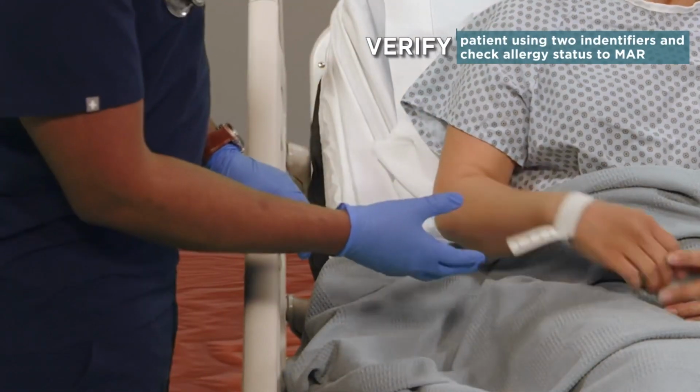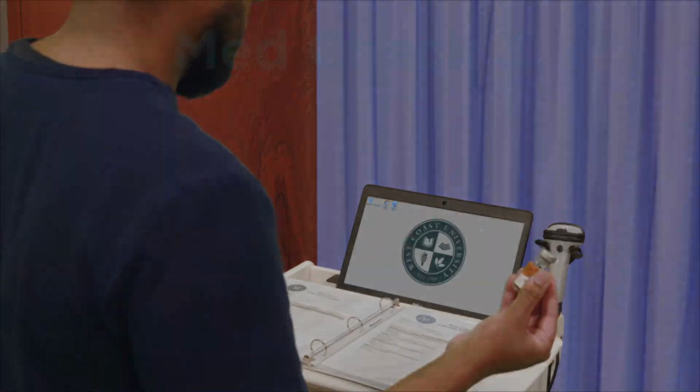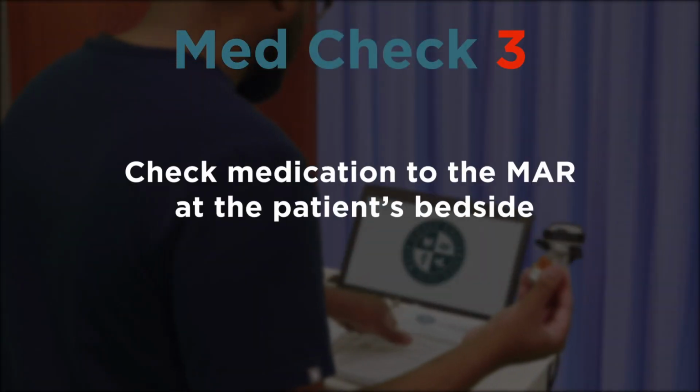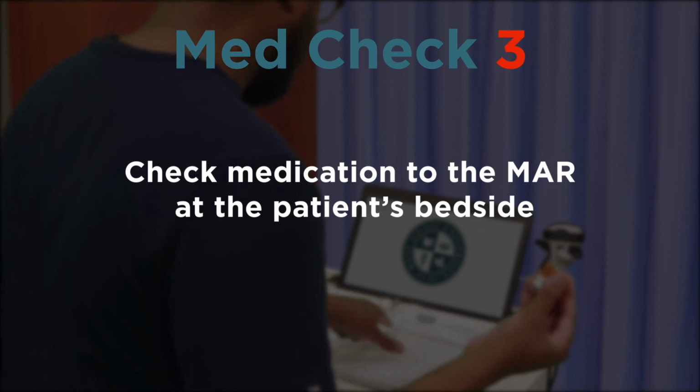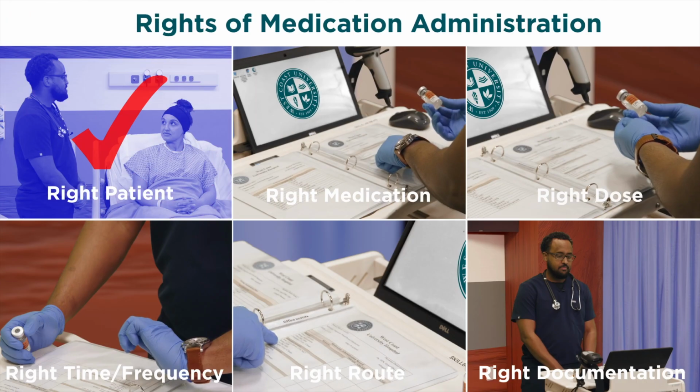Verify the patient using 2 identifiers and check allergy status to MAR. Med check 3. Check medication to the MAR at the patient's bedside. Perform the 6 rights of medication administration.